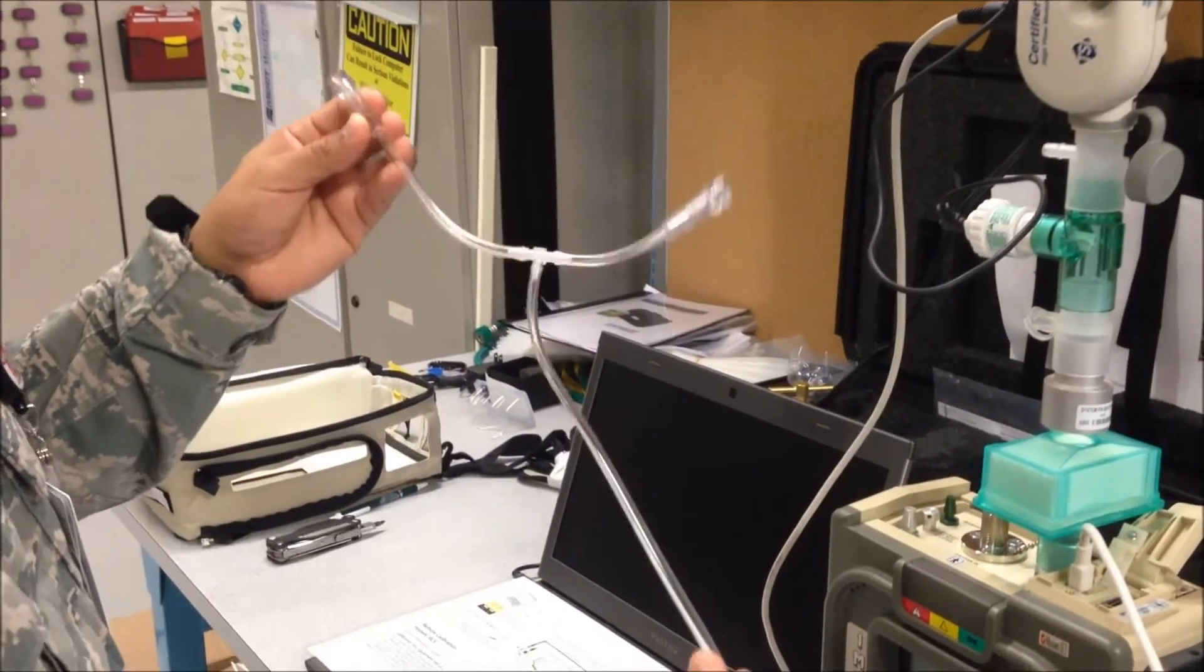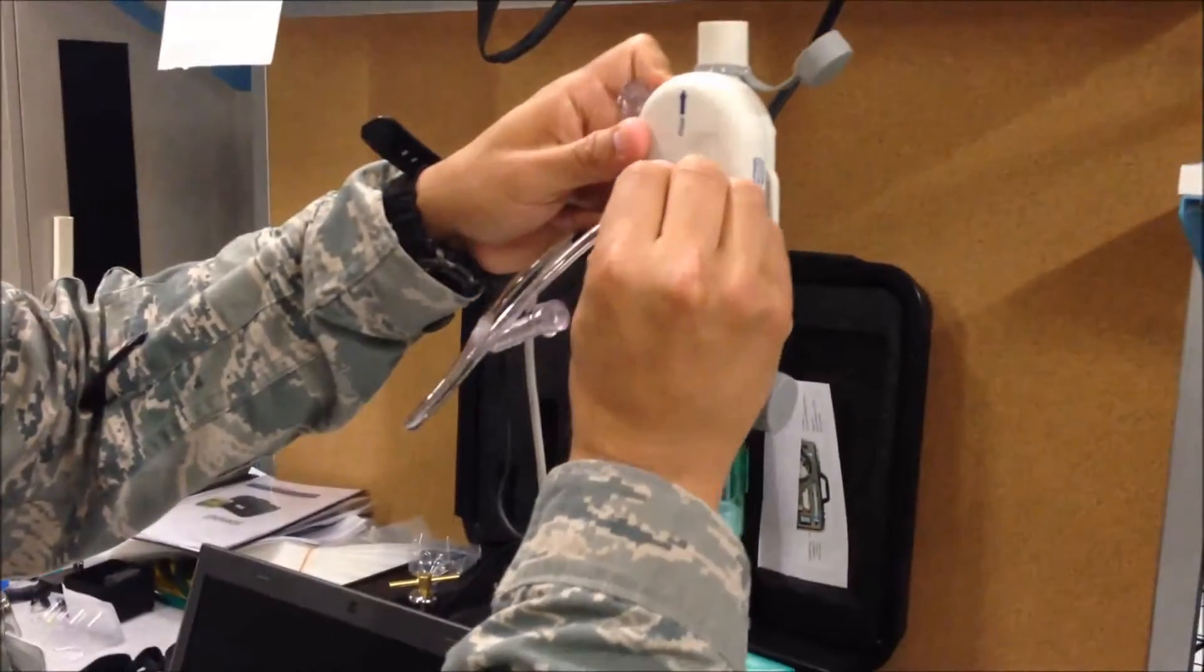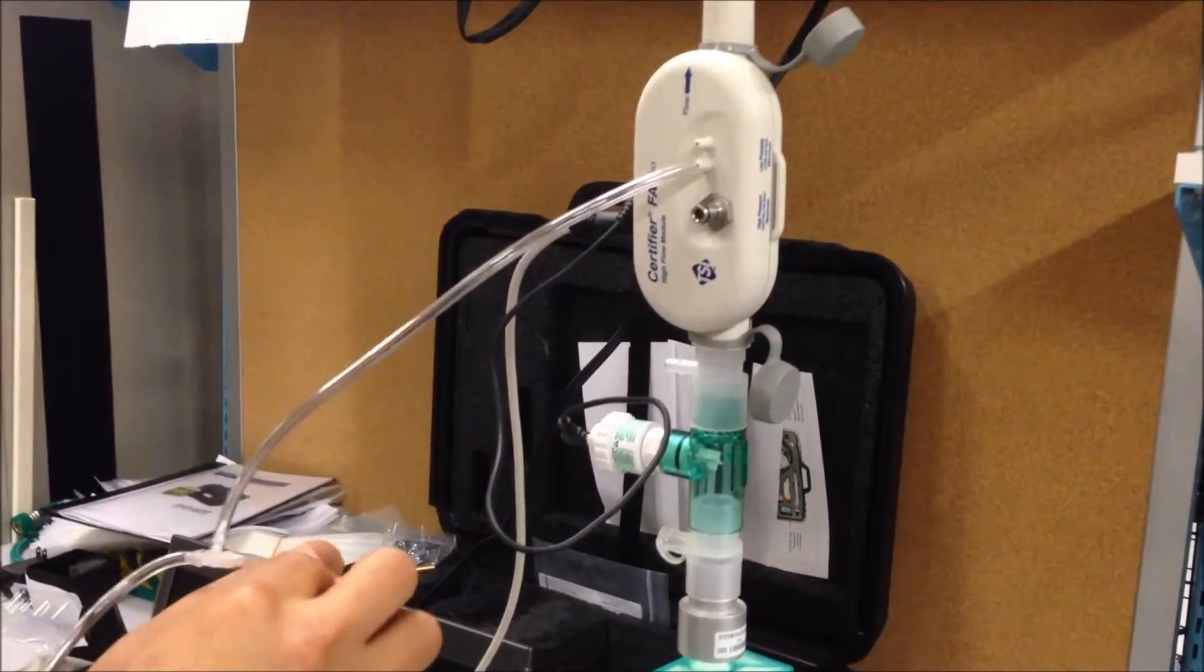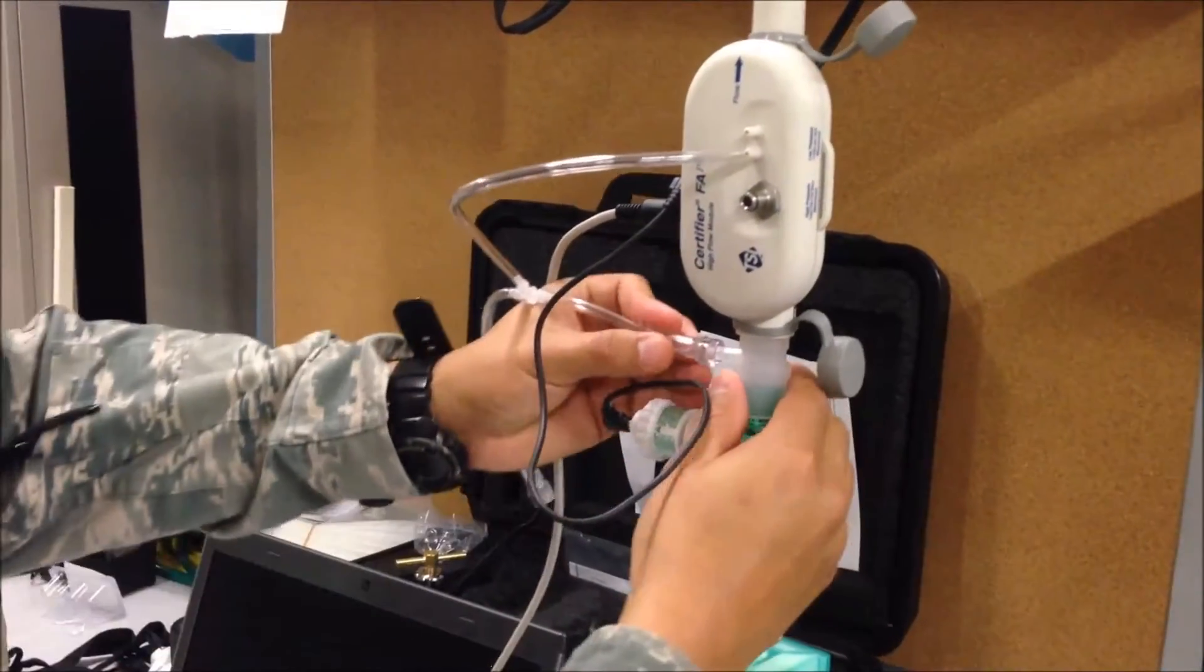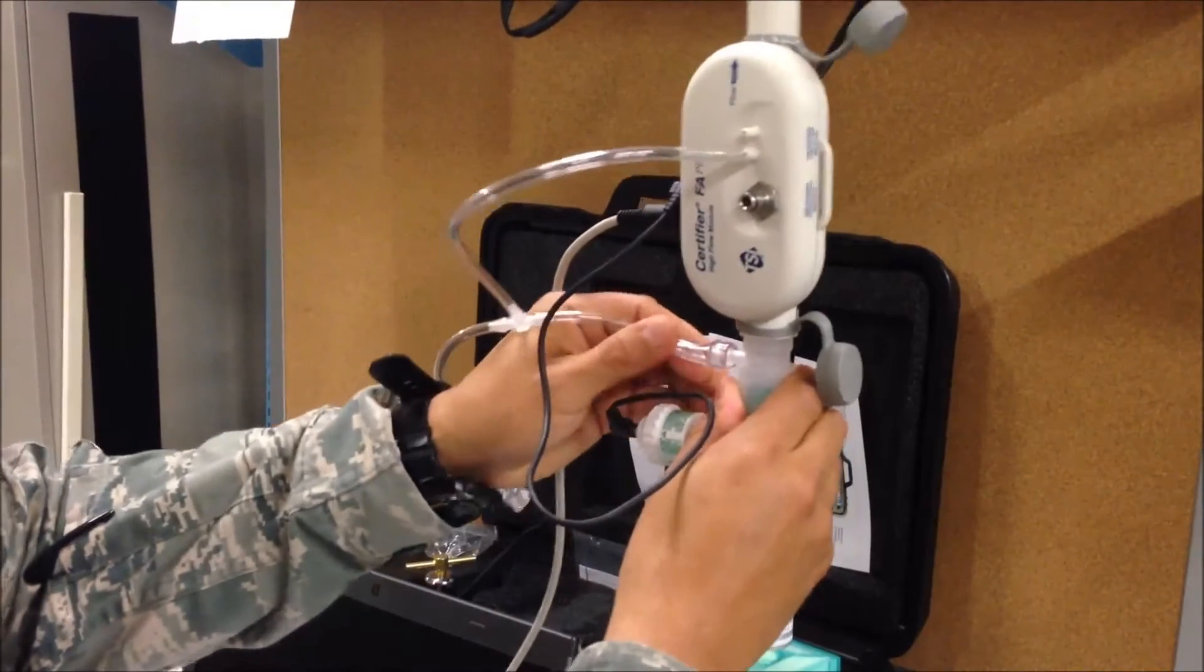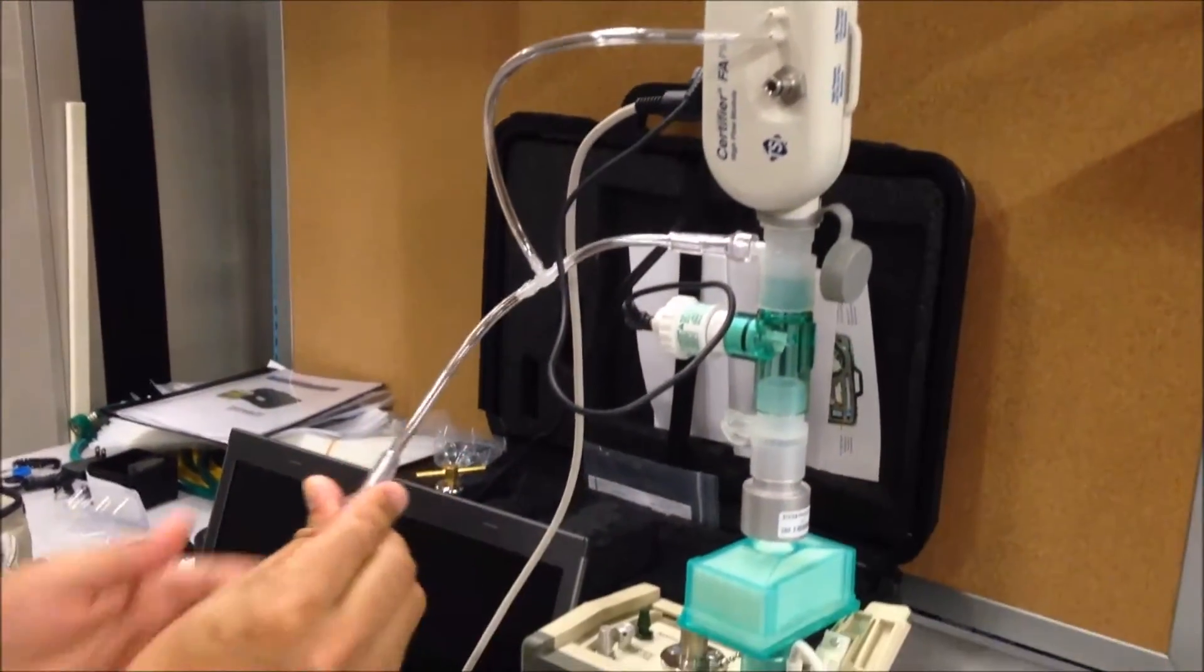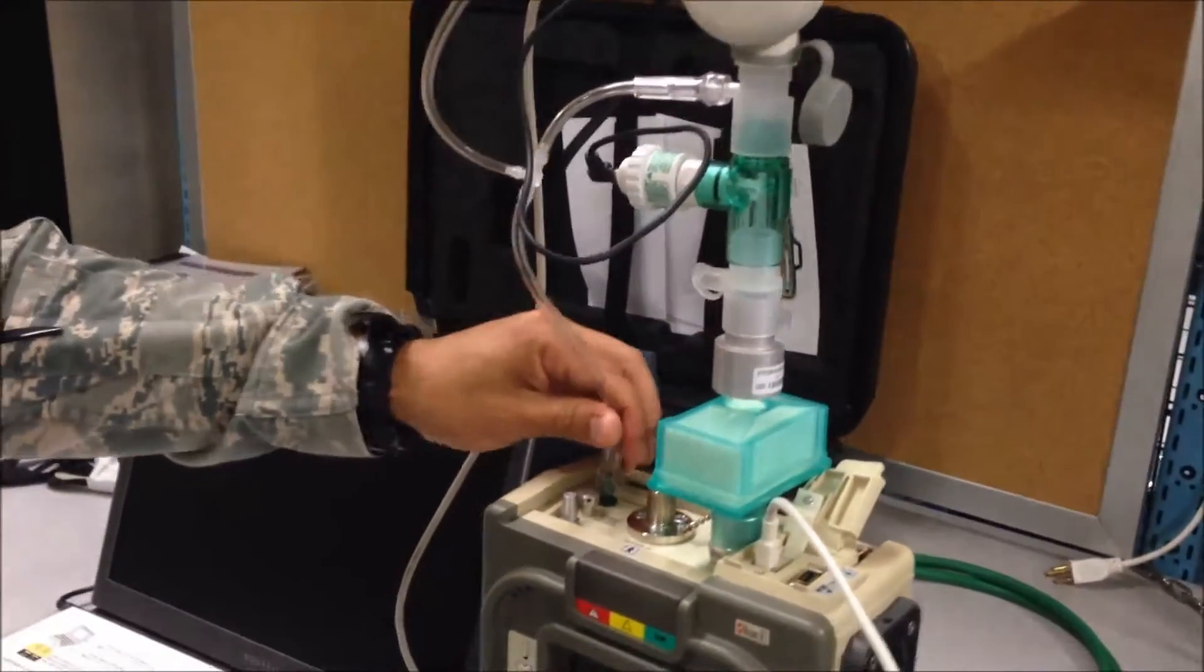Once this is created, connect it to the positive end of the high flow module. The other connection goes to the airway pressure Y-tubing and your final connection to the airway pressure transducer on the 731 unit.